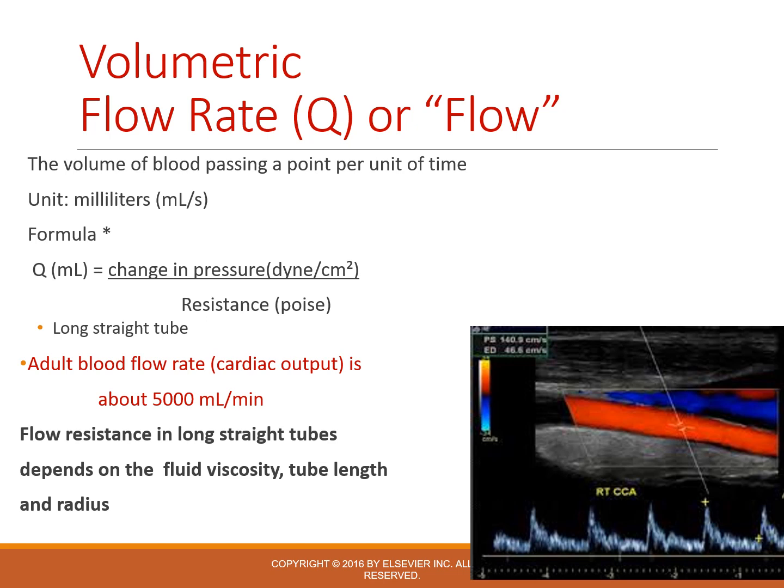So every time we flex our calf, that's going to contract, that can squeeze a vein, and that can cause that forward motion of flow. On the other hand, if we have a patient that is completing a Valsalva maneuver, otherwise maybe they would be getting some flow up to their abdominal and then thoracic area back to that 0 point right atrium, but in the case of Valsalva, we're increasing that abdominal pressure so much, it's going to cut off venous flow. So we can use some of these types of maneuvers in order to check the flow and see if we have open veins or if maybe we have occlusion through thrombus or something like that.